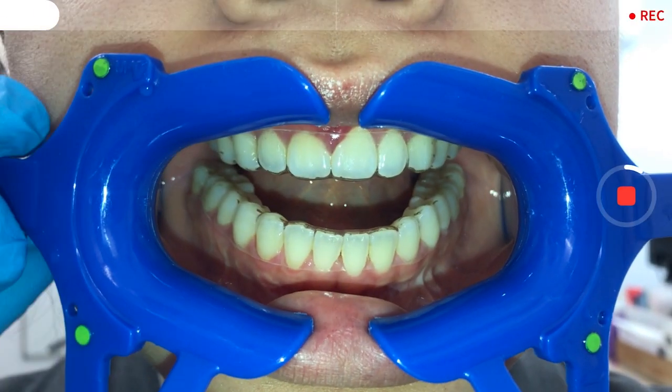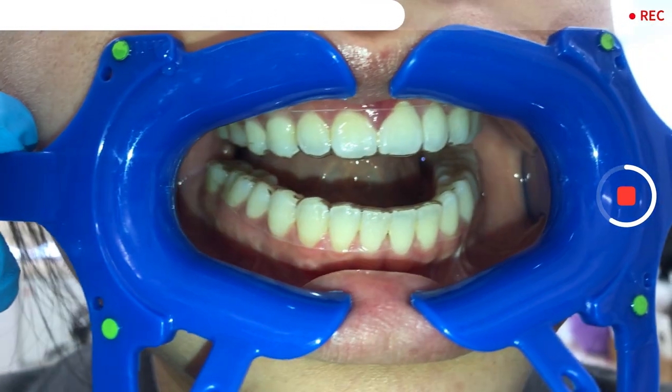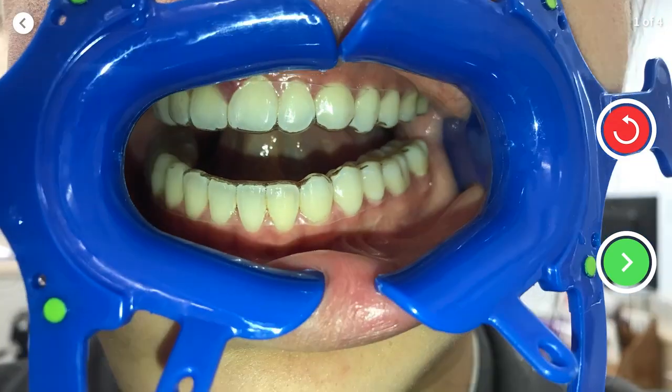When scanning, hold onto the right arm on the lip retractor and gently pull back while slowly turning your head the other way, using your right hand to push the retractor to the opposite direction to get your left buckle view.